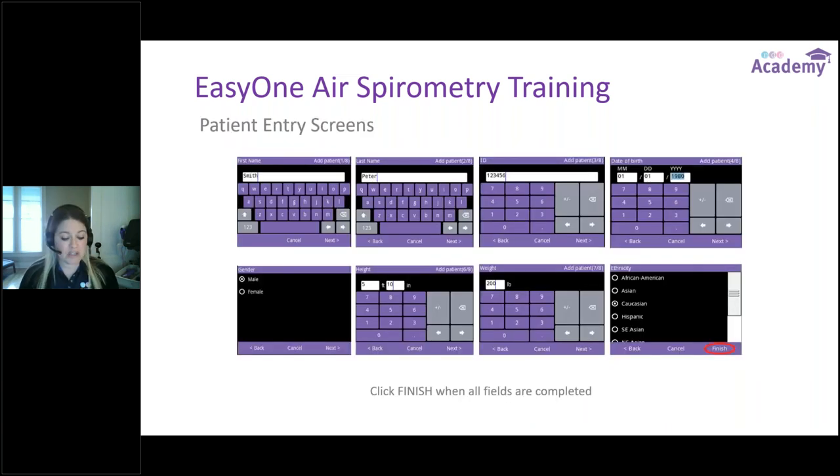The patient entry screens on the EZ1 Air have eight pages to go through. It's a quick touch screen entry that gives you the information needed to catalog the patient and establish predicted value sets. The fields are: first name, last name, patient ID, birthday, gender, height in feet and inches, weight, and ethnicity. Click finish when done and it returns you to the main menu, ready to test.